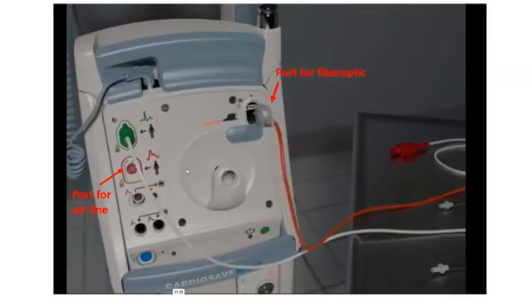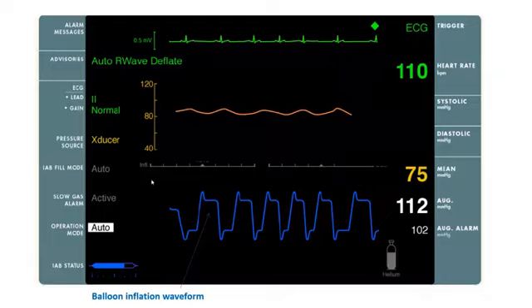Would it be your fiber optic line or your arterial lumen? It's not an issue with augmentation itself or with the balloon catheter. The patient is still getting proper augmentation. You and the balloon console are just not able to monitor it.